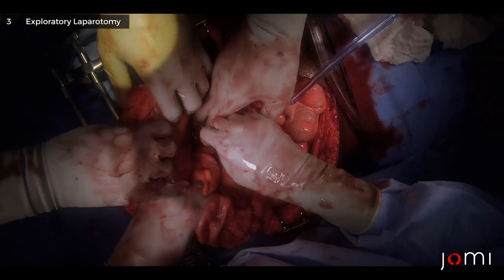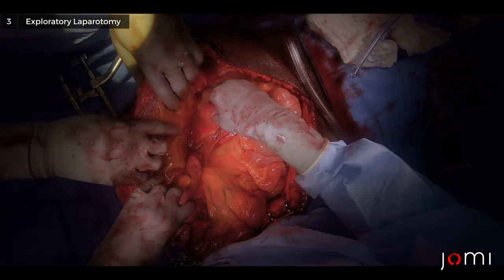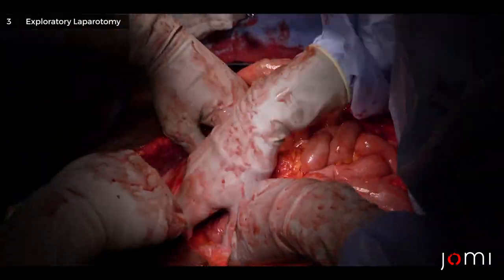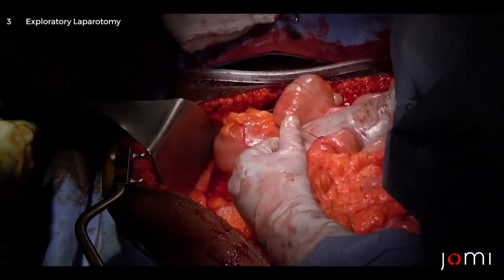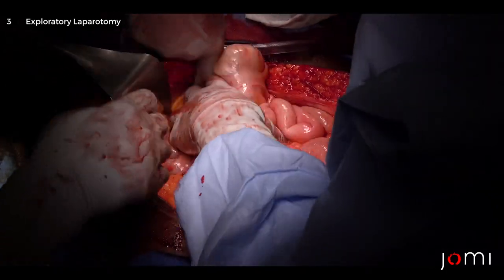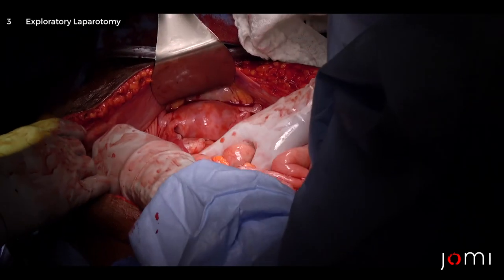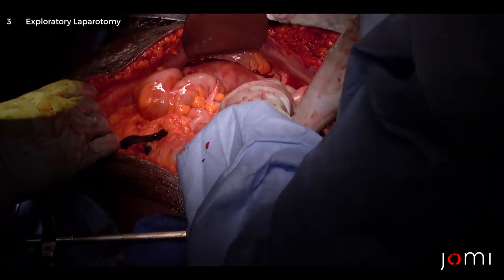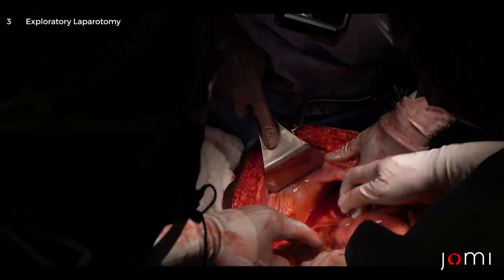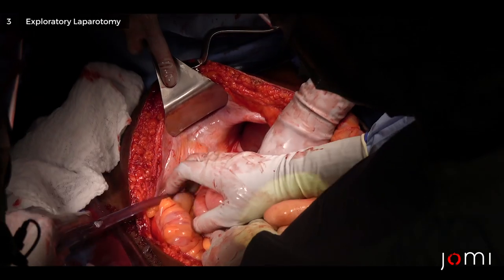Beautiful anatomy here — nothing there. Her kidney is like floating right there. Keep moving. Nothing — and just go around clockwise: Zone 3 left, Zone 3 for your iliacs, Zone 2 for your left kidney, Zone 3 for your left iliacs — nothing. Zone 3 on the right — nothing. So that's a quick look for retroperitoneal hematomas — none identified.